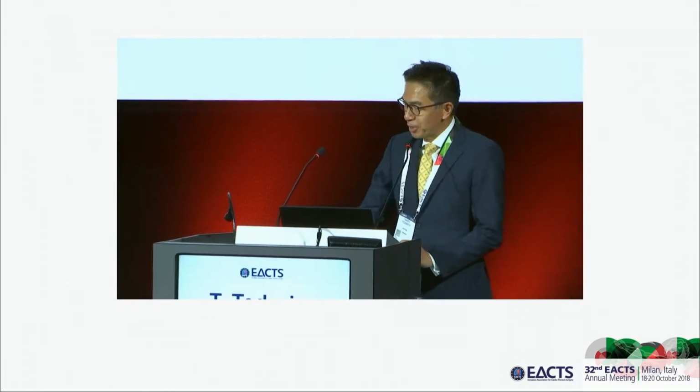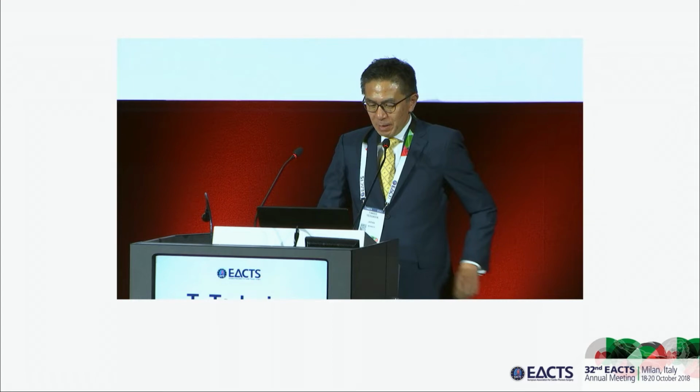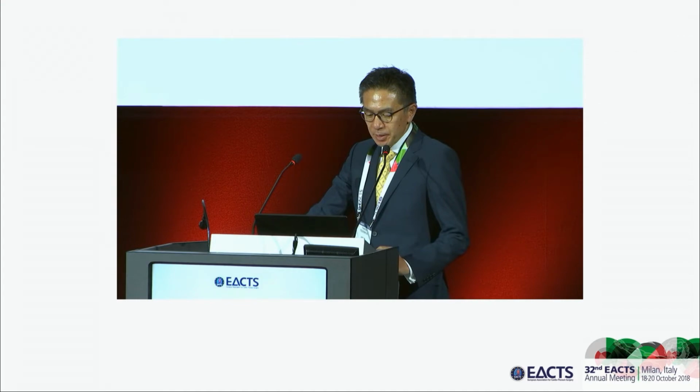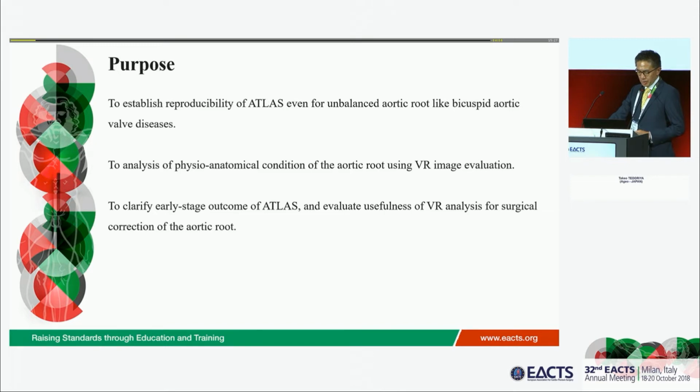So my presentation is a little bit different from aortic valve repair, but our aortic valve reconstruction with 3 same-size autologous pericardium leaflets has been performed for patients with narrow aortic root or contraindication for valve prosthesis. Since this procedure requires precise information of the aortic root, including configuration of the valvular sinus, we assessed physiologic and anatomical condition of the aortic root by virtual reality VR images in order to accomplish this technique in a reproducible fashion. The purpose of the study is to establish the reproducibility of our procedure and analysis of physioanatomical condition of the aortic root using VR image evaluation, and also to clarify early stage outcome of our procedure.